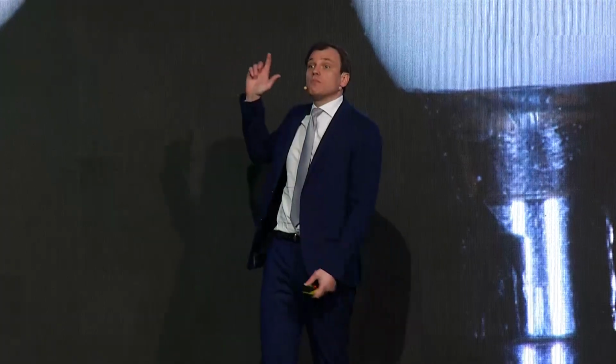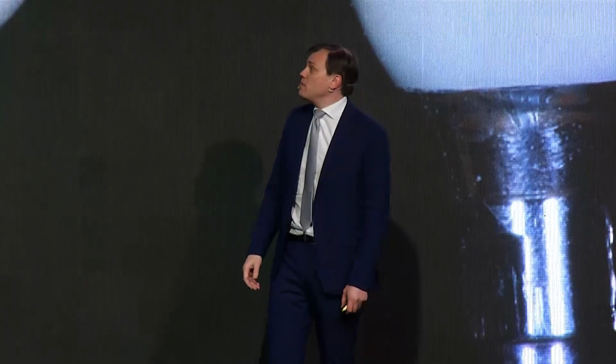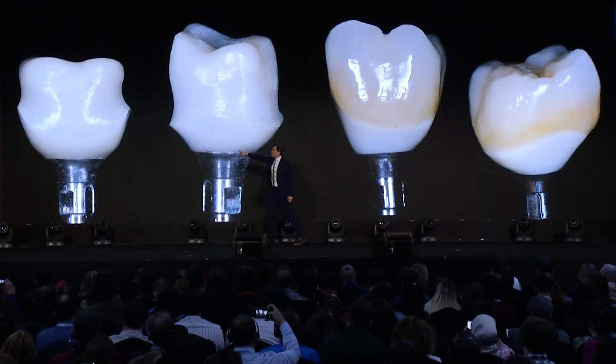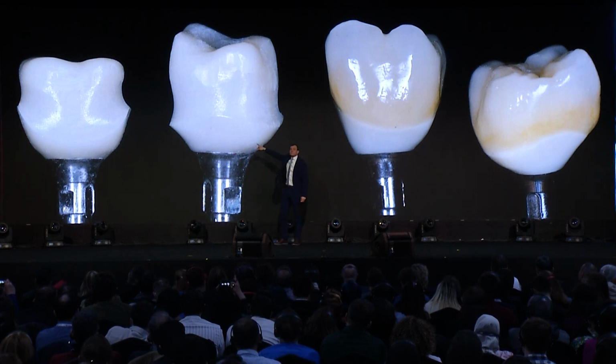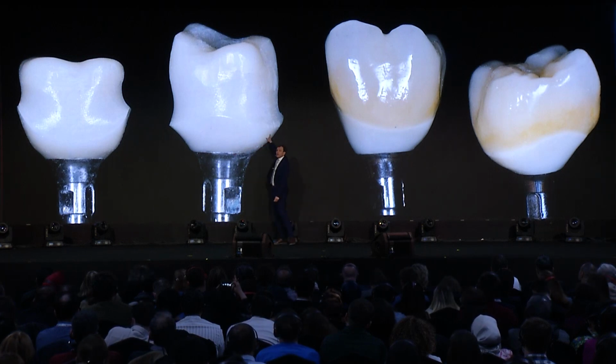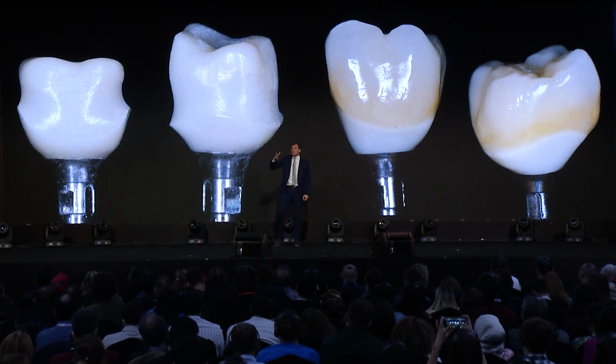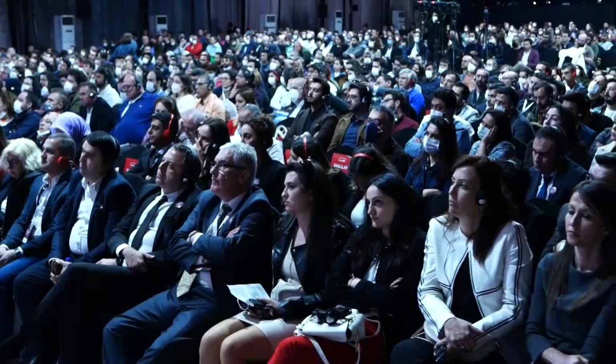I'm going to show you some 10 years follow-up because, as I said, I'm working with this zirconia for many, many years. One of the first cases you see, again, by the implant design, by prosthetic design, we would probably do differently now. You see white, snow white zirconia, which was the first zirconia which entered the market.